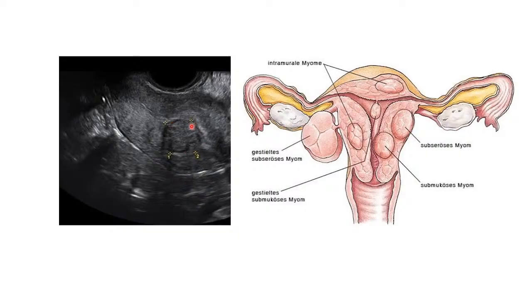So you can see again here we have got an endocavitary fibroid there. You see the challenges of these endocavitary fibroids, because it's seated in the endometrial cavity where implantation is supposed to happen. So this is blocked implantation. So this patient is most likely going to be very much infertile because of this fibroid that has found its comfort there.